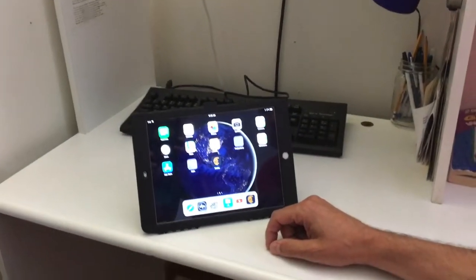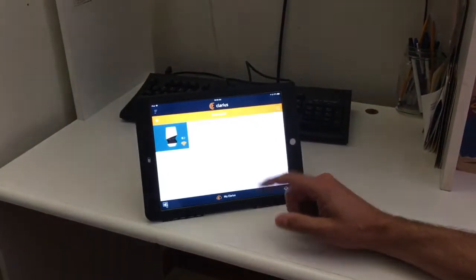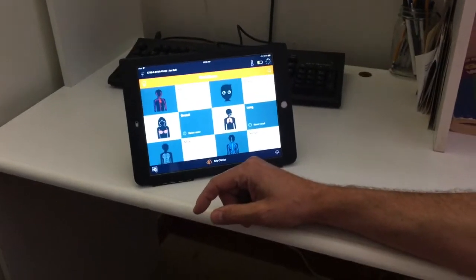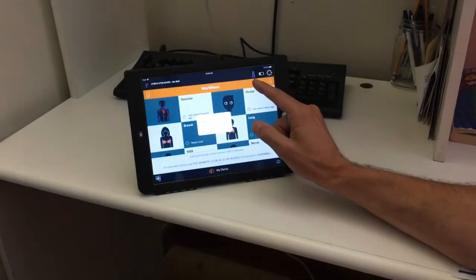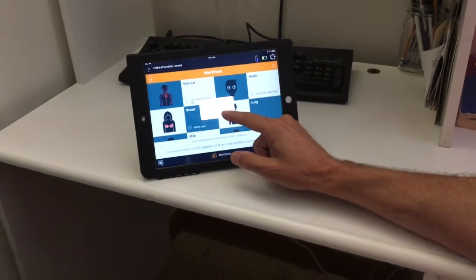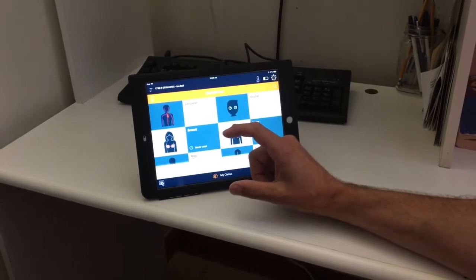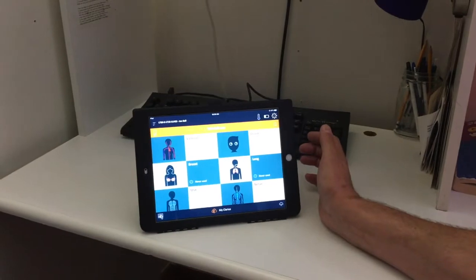When we open the app, we see the ultrasound probe and just touch to connect. It's going to show us our battery life and the heat being put out by the device. We hit join, and since this is a direct Wi-Fi connection to the probe, it's very robust.